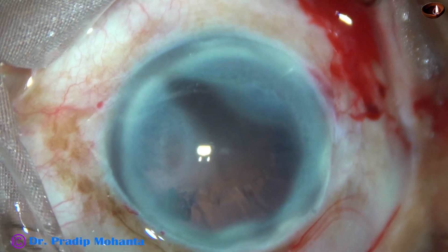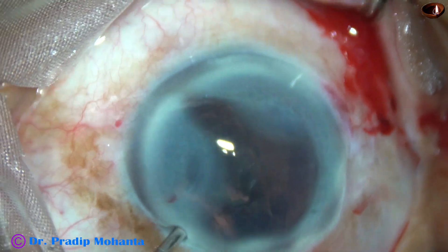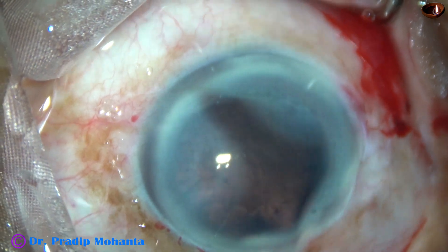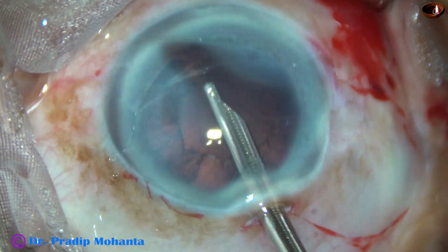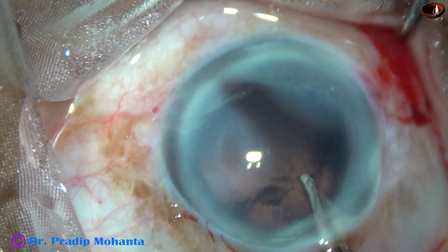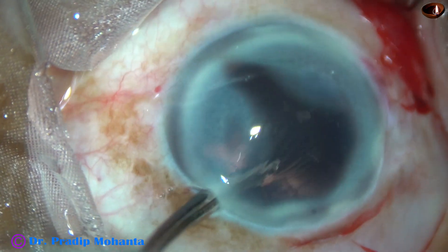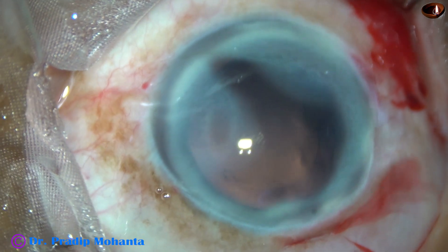The nucleus has been managed. Now cortical cleanup is to be done. There is a small bit of nucleus which was near the left side port — this small piece must be removed first before removing the cortical matter. And now the cortex from all around is being removed by this 23G Simcoe cannula. The sub-main-incision cortex will be removed going through the left side port. This is a 23G Simcoe and it goes through a small side port — width of this side port is about 1.7 millimeters.